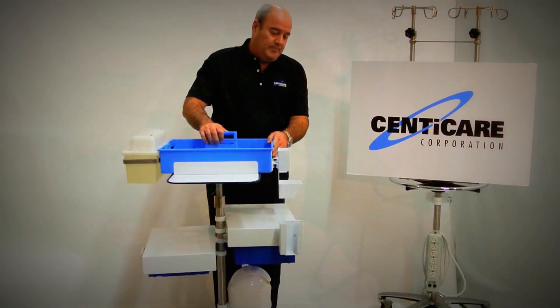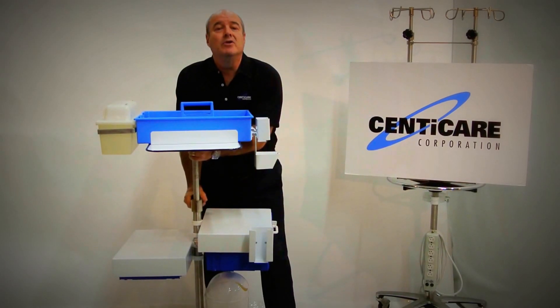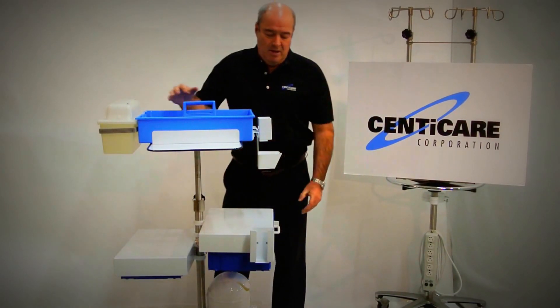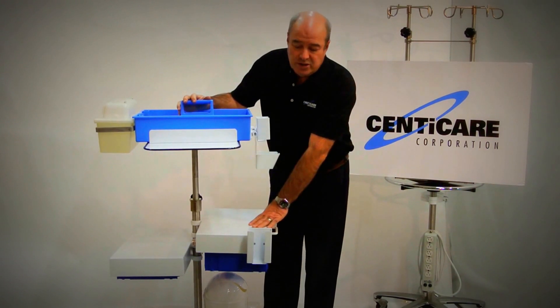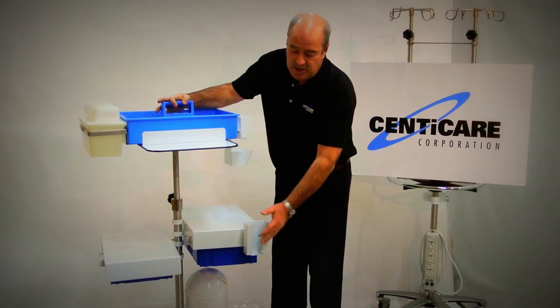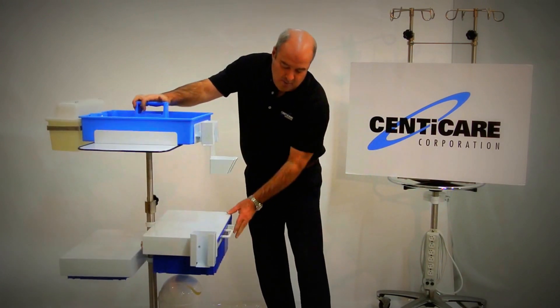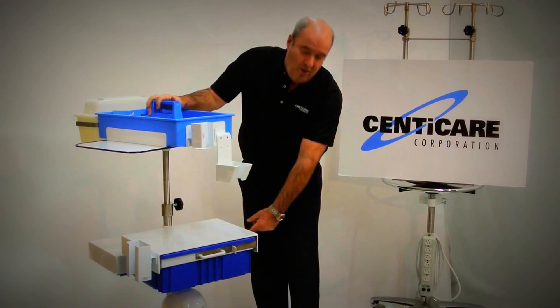The actual unit is fully adjustable for any of your taller personnel. Our drawer is another working surface for many people. This one also has more storage for gloves. And then down below we have a container for waste products.